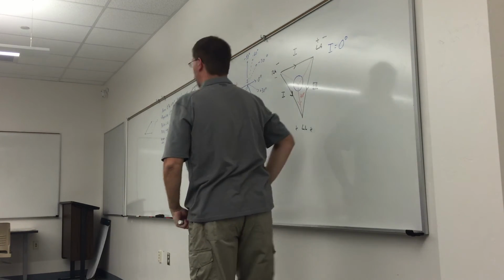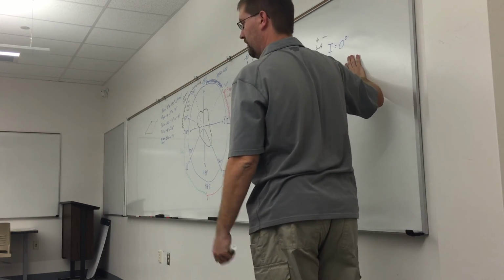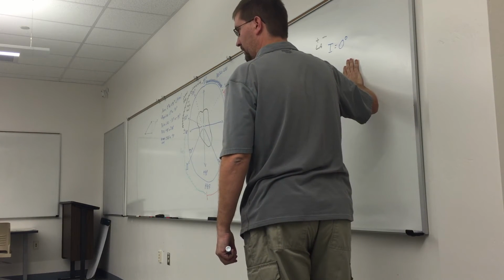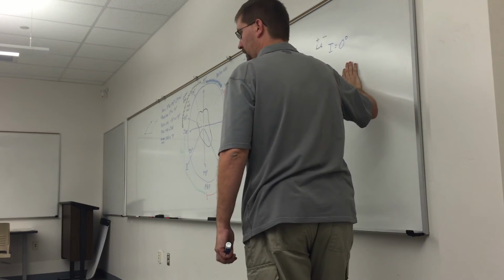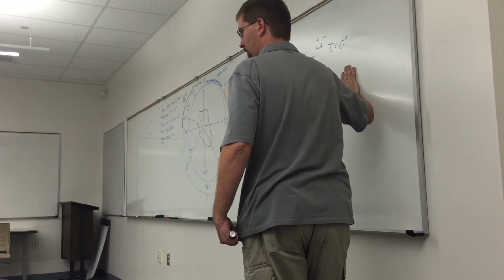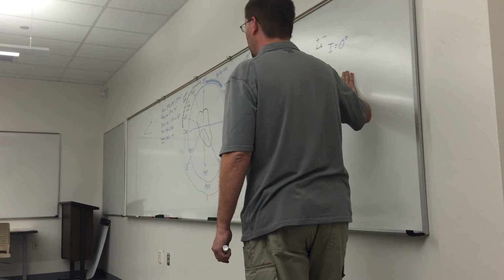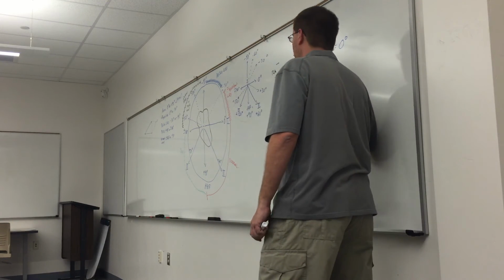This is why I asked: based on what you just said, if I take the leads and I put them here in the front instead of right smack dab in the middle, I'm going to get an altered picture. It might a little bit, but still, it's looking at the average axis. So it doesn't matter all that much.